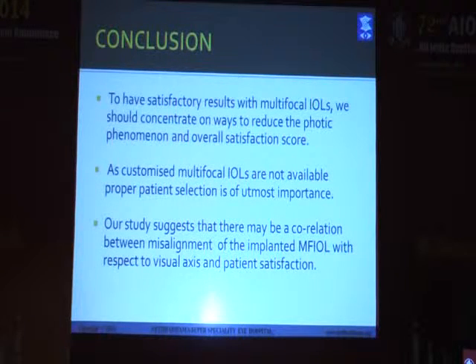As customized multifocal IOLs are not available, proper patient selection is of utmost importance. Our study suggests that there may be a correlation between misalignment of the implanted multifocal IOL with respect to the visual axis and patient satisfaction.